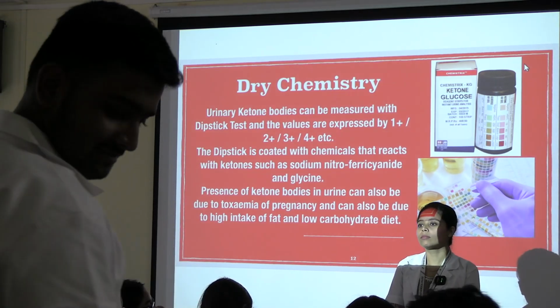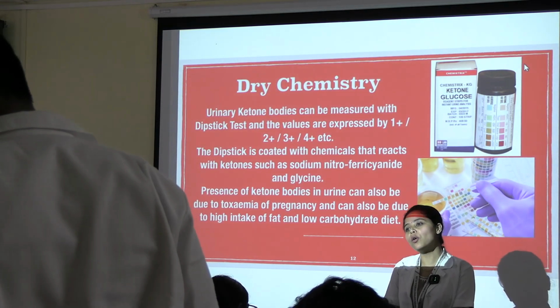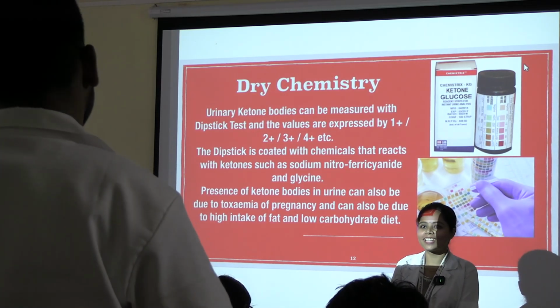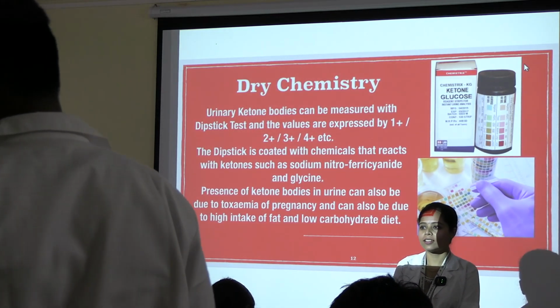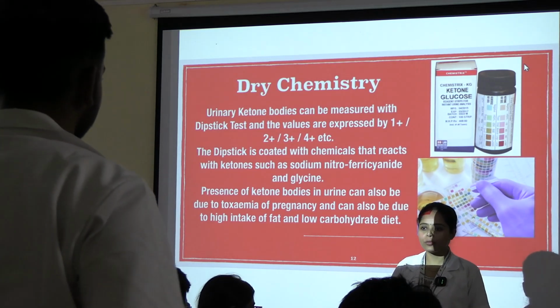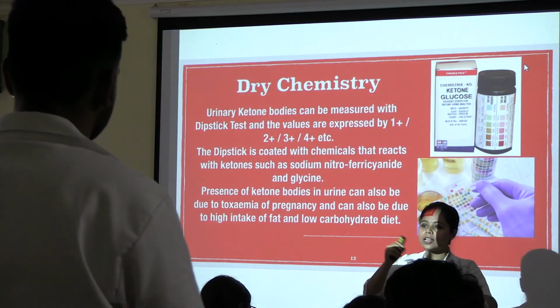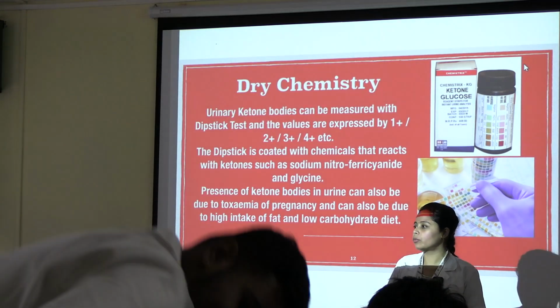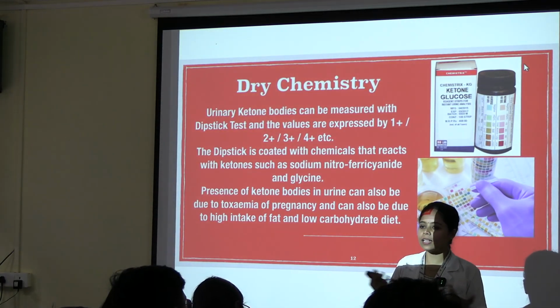Chemistry with no water. Chemistry without water is dry chemistry, where we don't have to perform with chemicals, heating and all that. Where we don't have to heat it, we don't have to use chemicals or reagents, that is dry chemistry.